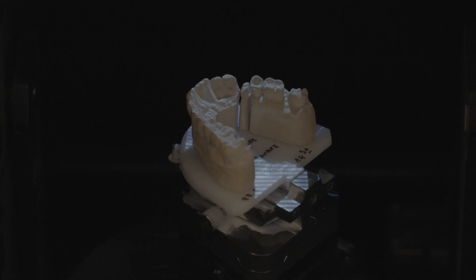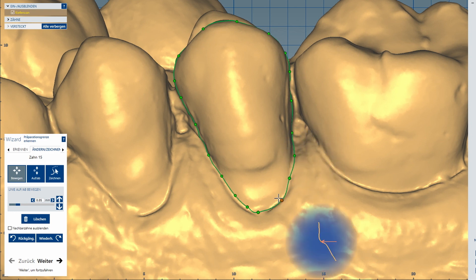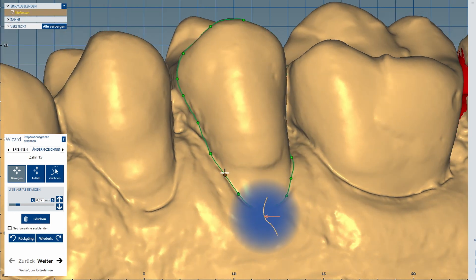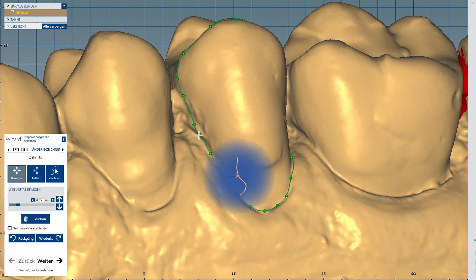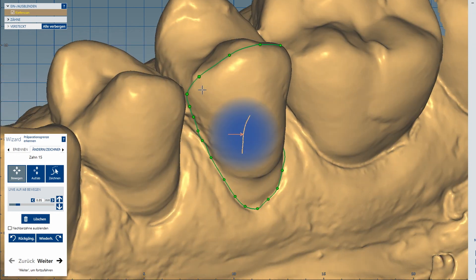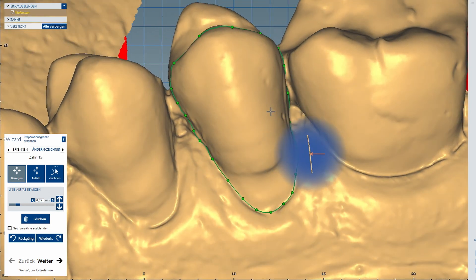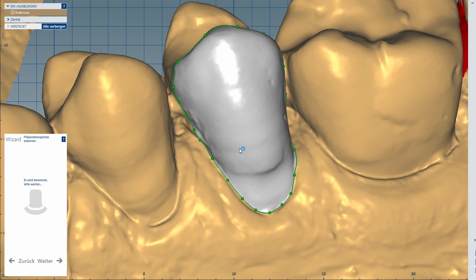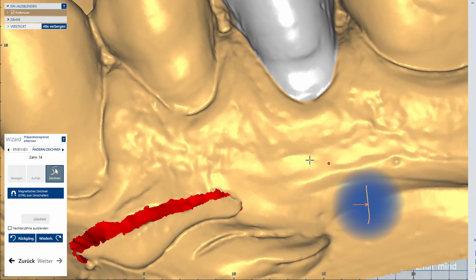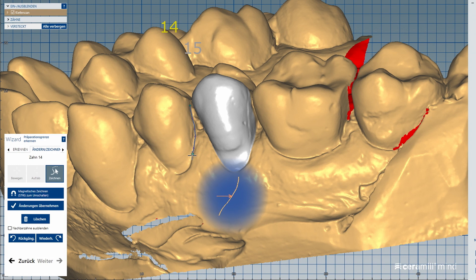Then we start the scan process. First, let's start by determining the preparation limit. Since we adjust the veneers on unprepared teeth in this case, it is not recommended to use the automatic edge detection. I determine the course along the gum line and go slightly over the edge in the area of the incisal edge. I do the same with the other teeth to be treated.